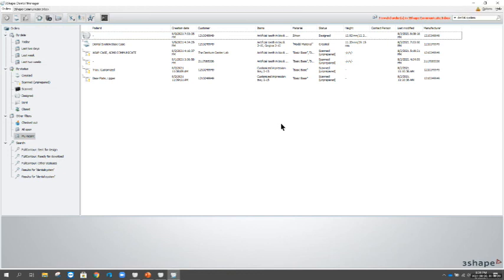Actually, one just popped through, and that was specific to implants. Could the software calculate gingival thickness? I mean, to a degree. If you're talking about gingival thickness around an implant site, as far as the emergence profile area, yes, you can measure that. But anything below that, like using a CBCT scan and overlaying your surface scan and then measuring, the dental system software doesn't accept CBCT scans unless you can convert them to an STL.